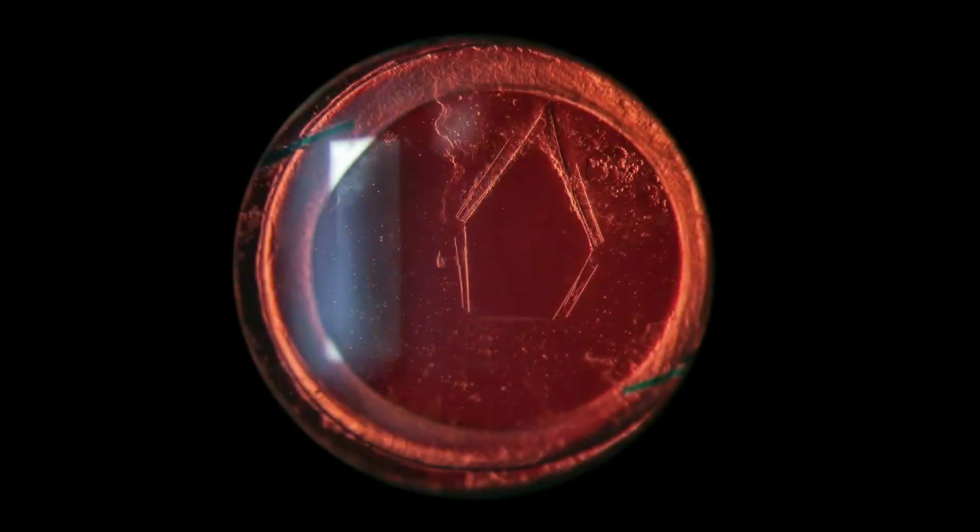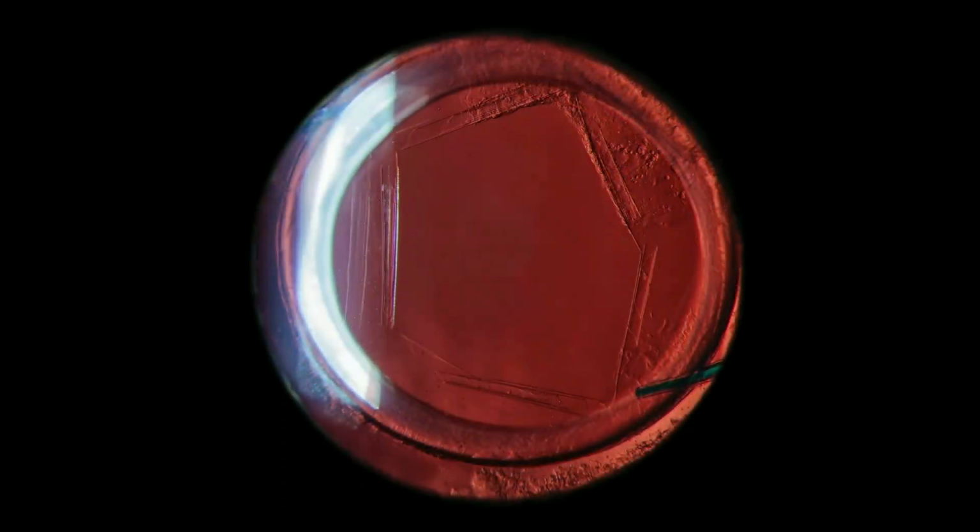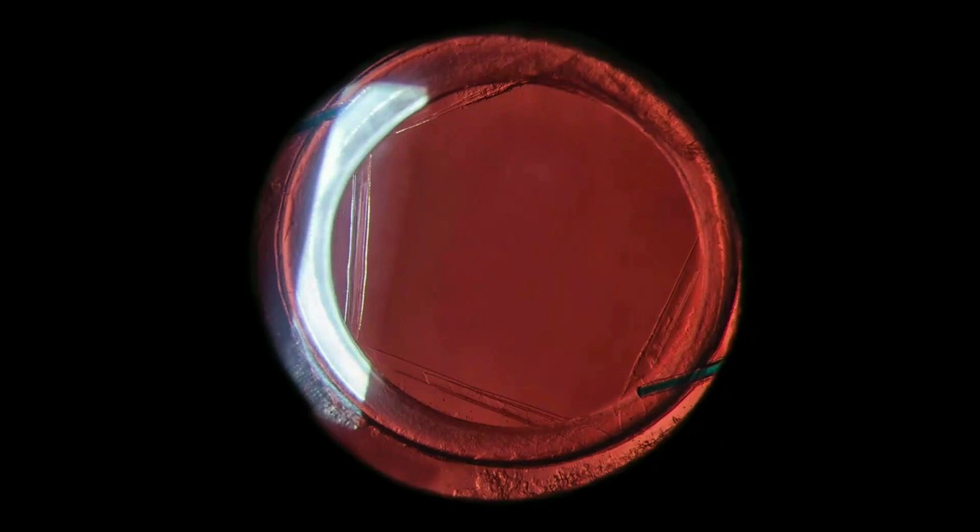Assuming a perfectly sized rhexis without the risk of a vitreous prolapse into the anterior chamber, I try to achieve a posterior capsule opening between 5 and 6 millimeters.